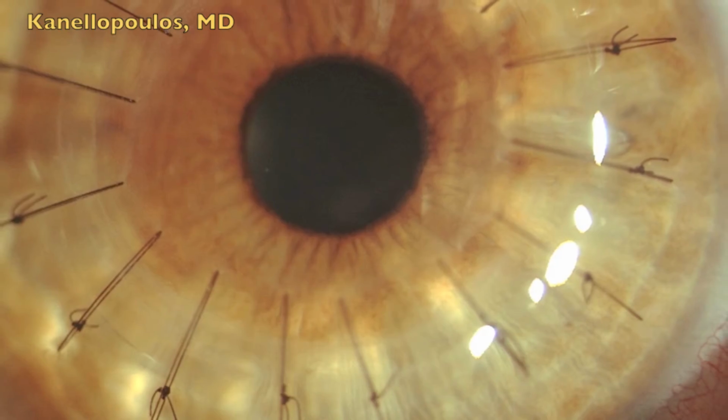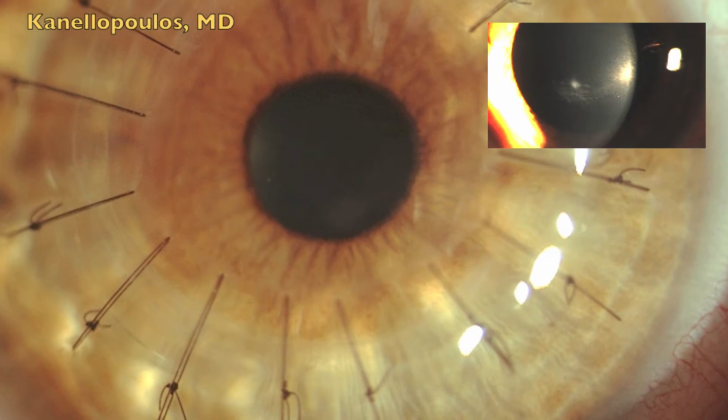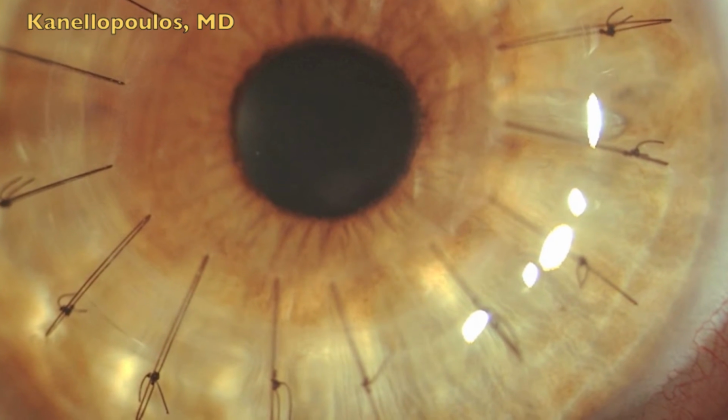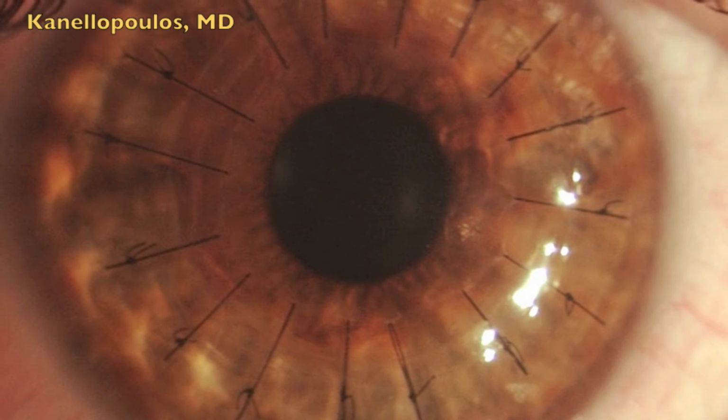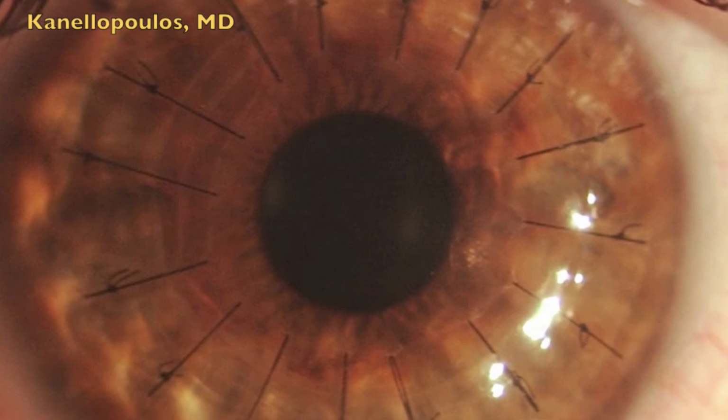Here, some months later, the patient. You can see the pristine graft, and we're going to take a closer look soon at how the actual graft-host interface looks, and trying to appreciate the beauty of the mushroom and the step that is being created here. Some cross sections of the graft-host interface where we can actually appreciate that step between donor and host, enlarging significantly the interface of transplant and host. Again, different shots, and we're going to go to OCT imaging to get a better view of what I'm trying to show here on the slit lamp.